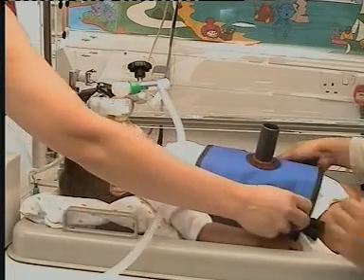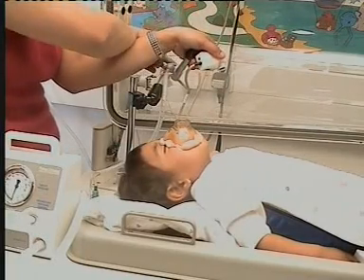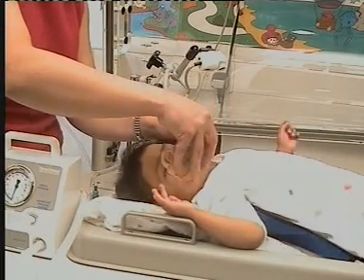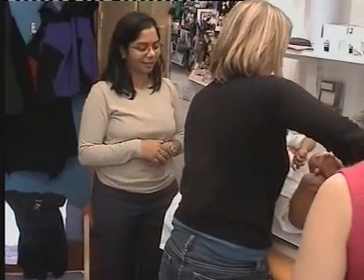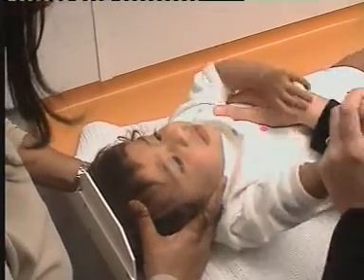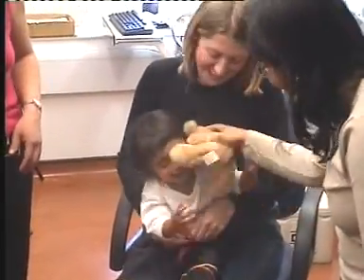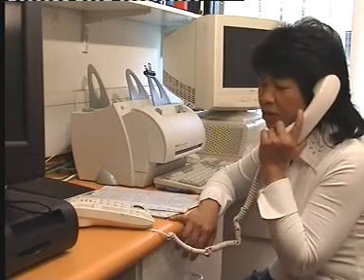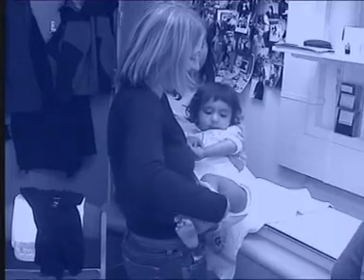After the tests are finished, the jacket and face mask are gently removed. Infants usually sleep through all these measurements, but begin to wake towards the end of the test or as soon as the face mask is removed. Measurements of body length using a calibrated stadiometer are usually undertaken at the end of the test, since this is better tolerated while the infant is still drowsy. After completion, the infant can be changed and fed before returning home or to the ward. If returning home, parents should be given a phone number to contact staff in case they have any questions or concerns, together with details of the sedation used and any possible side effects. The child may be drowsy or unsteady on their feet for a few hours and should not be left unattended.